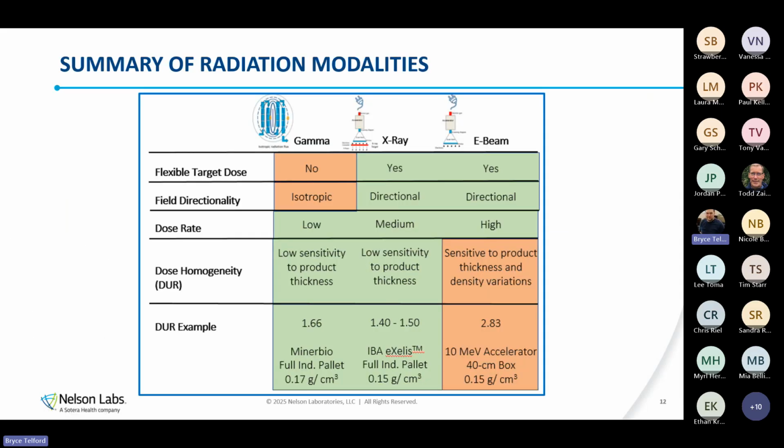So, a summary and comparison. Flexible target dose, gamma, no.